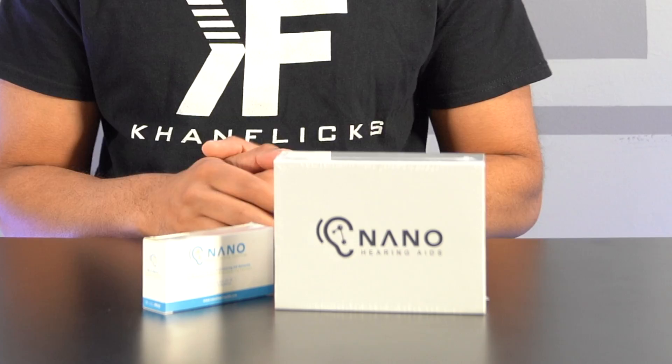What's up everybody? Welcome back to an all new episode of Khanflicks. Today we'll be looking at some Nano hearing aids. Now if you're in the market for this, you're probably dealing with some kind of hearing deficiency, and being a pharmacist as well as a tech reviewer kind of worked out quite well.